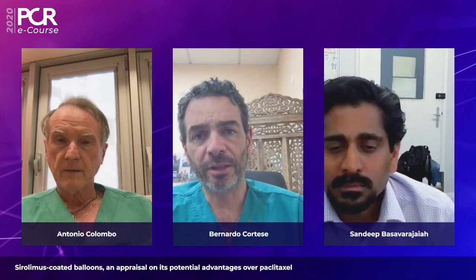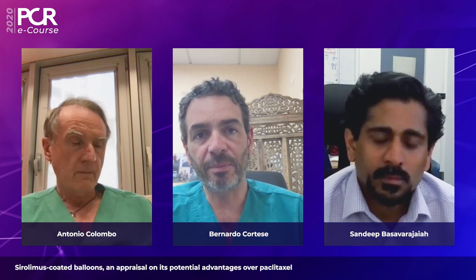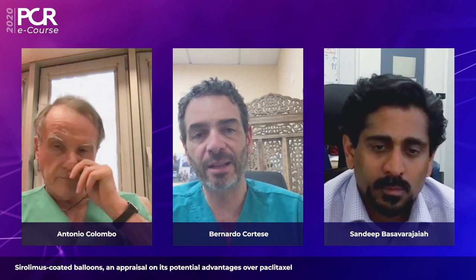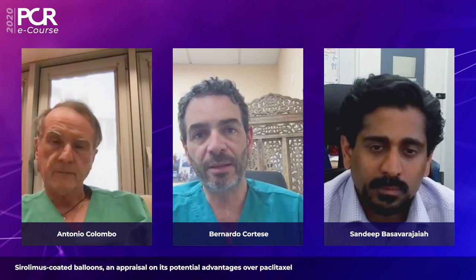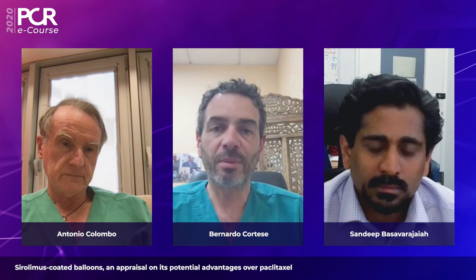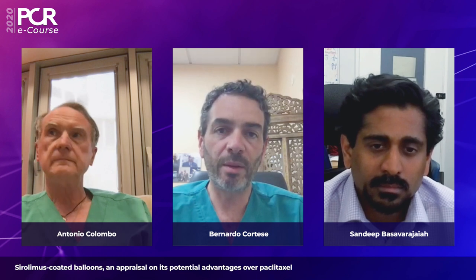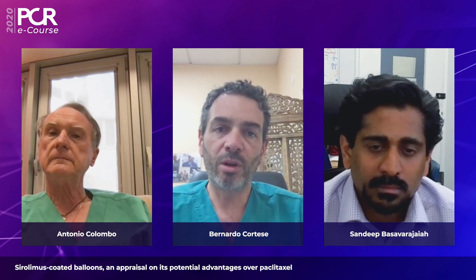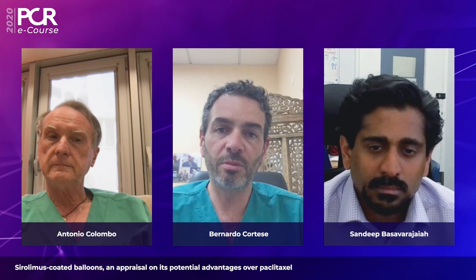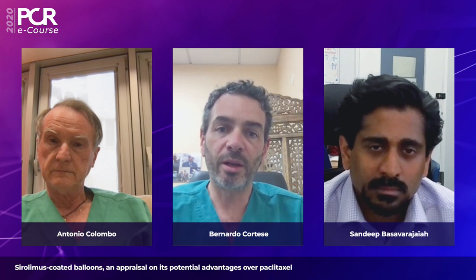What do you think about the deliverability? Because we've seen that other devices with Paclitaxel have slightly improved their deliverability and trackability. But what I have always asked myself is, we have a new concept balloon, it's working very well, but how is it possible to have such a complex technology on this balloon in order to have it very effective, but also very deliverable and trackable?